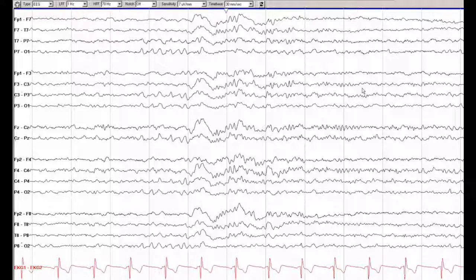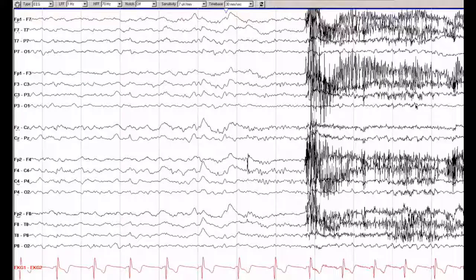Here is another example of a more complicated K-complex, which you can see has several phases. The origin of the name of K-complex is the subject of some dispute. However, there is some evidence to suggest that the K might stand for knock. K complexes are generated during arousals and often generated during external stimulation, such as when a technologist knocks on the wall or the door. It is common to see K complexes preceding an arousal.